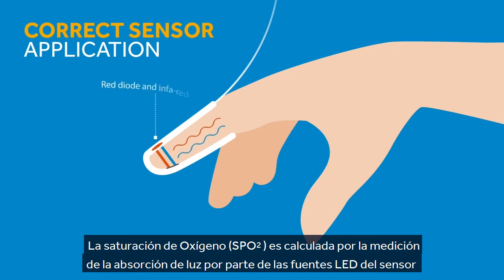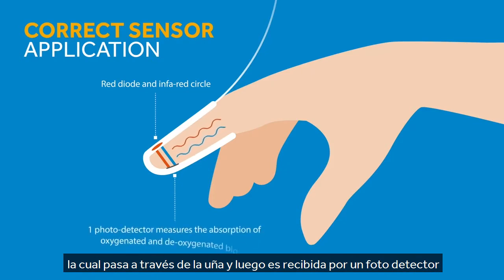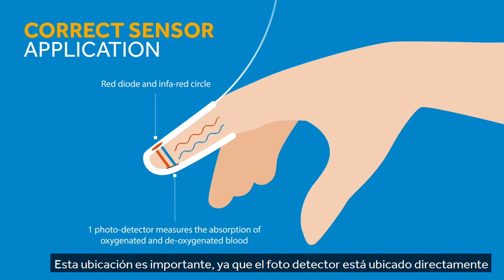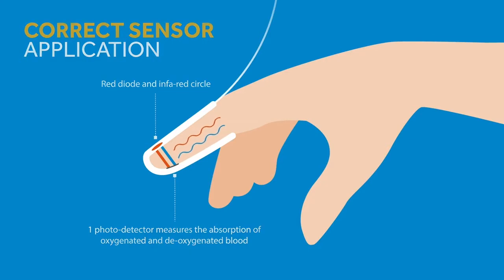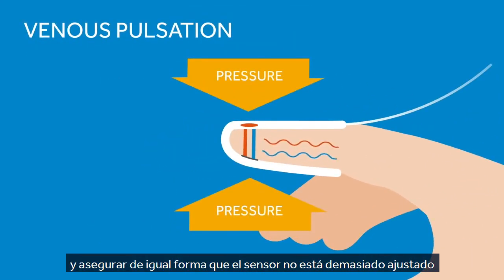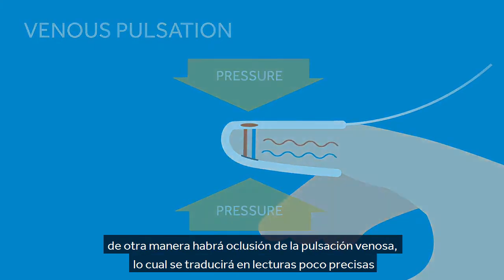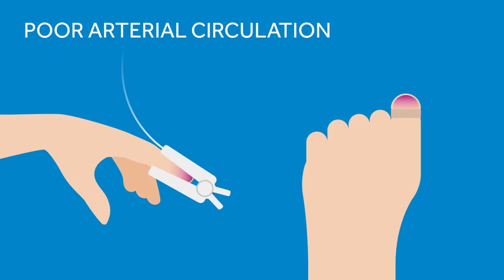SpO2 is calculated by measuring the absorption of light from an LED source, which passes through the nail bed and is then received by a photodetector. It is therefore important that the photodetector is placed directly opposite the LED to ensure optimal readings. Check the sensor site regularly for skin integrity and to ensure the sensor is not too tight, otherwise it will cause venous pulsation, which will give inaccurate readings.